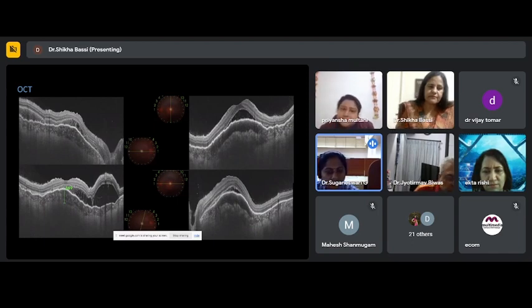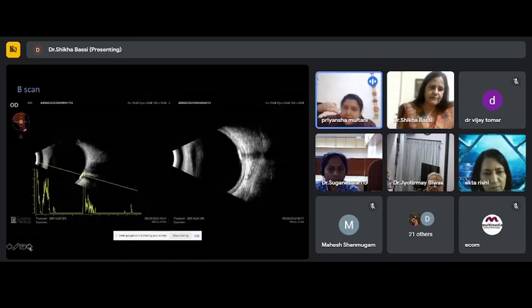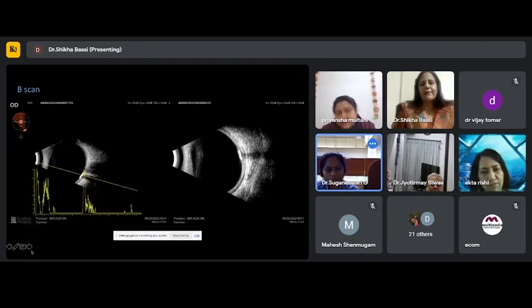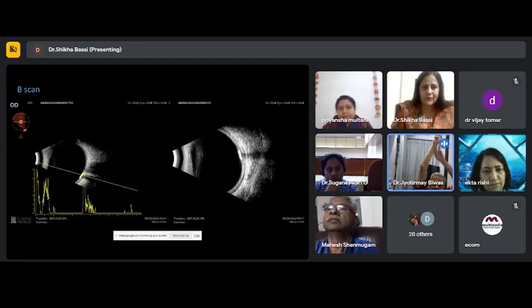Ma'am, move on to the next slide where the ultrasound is. In the right eye, I felt that... Stop at this, ma'am. Yeah. In this particular ultrasound, what we are seeing is definitely some amount of calcium with so much back shadowing, which we can appreciate. So, MPS sir, what is your thought process on this ultrasound? I agree that there is calcium on this. That is the right eye. But the left eye, I don't think it's showing calcium. There is a calcium plug.